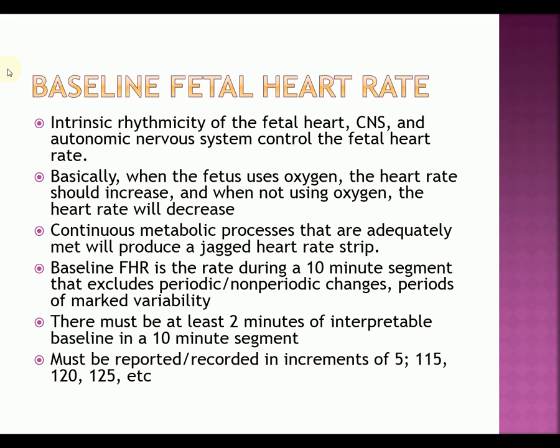So in order to read fetal monitor strips, you've got to know the baseline. So the baseline fetal heart rate, you're going to have those intrinsic rhythms of the fetal heart rate, where the CNS, your central nervous system, and your autonomic nervous system are what controls your fetal heart rate. So in order to see how well the CNS is working, how well the autonomic system is working, we actually study the variability and the accelerations and decelerations of the fetal heart rate.